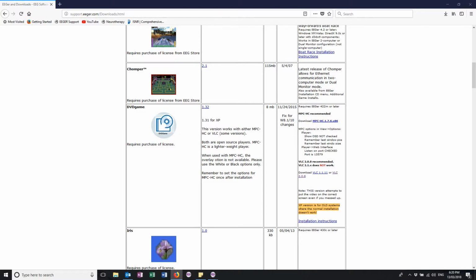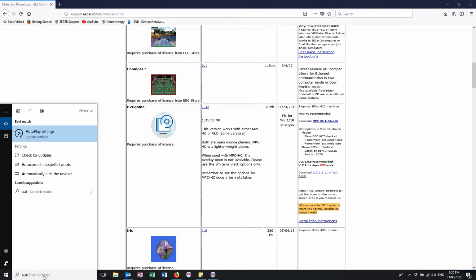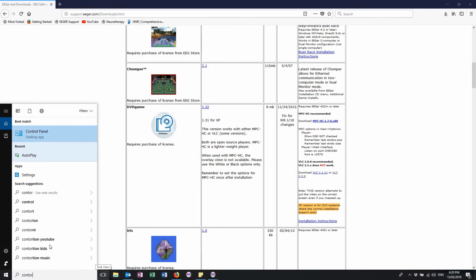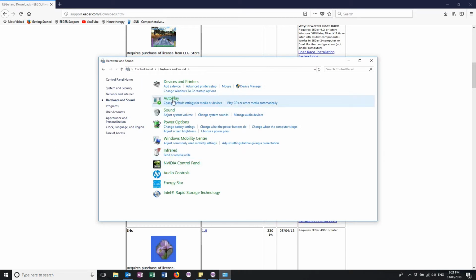and you're good. If that doesn't solve your problem, or if you had the right version to begin with, then the next thing we can do is we can check a setting within the control panel. So the setting is within Autoplay. So you could just type in Autoplay and find that, Autoplay settings. Alternatively, you can go to the control panel. You can go to Hardware and Sound, and then Autoplay.